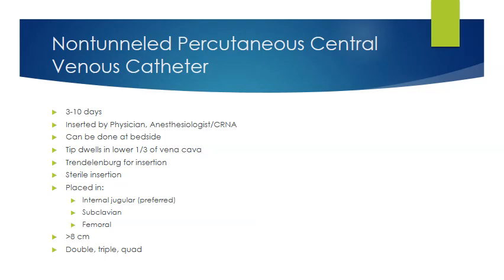But there is another reason, and the other reason is it decreases the risk for air embolism. And we talked about air embolism with complications, and so you understand what that is. And so if we can put them at that angle, it's going to decrease the risk of an air embolism getting in there. And I know you guys figured that out before I even said.